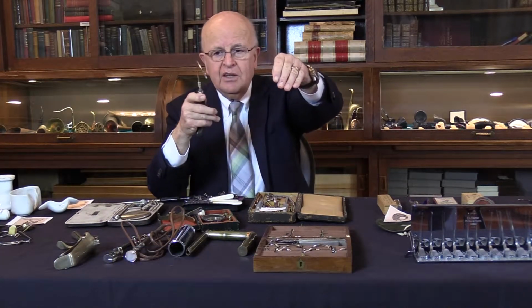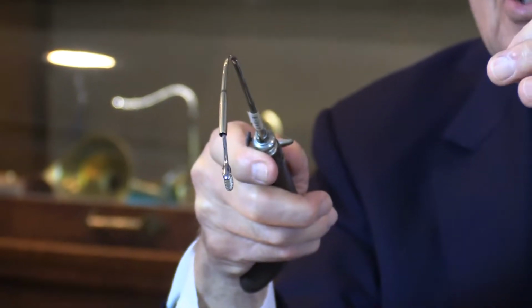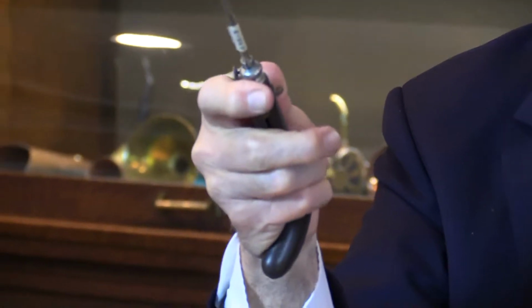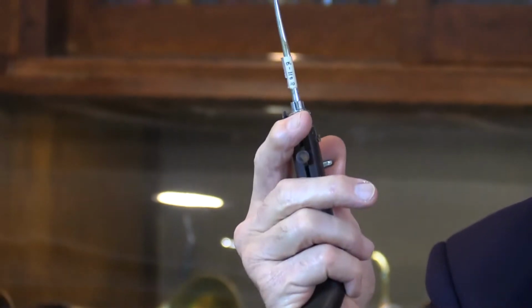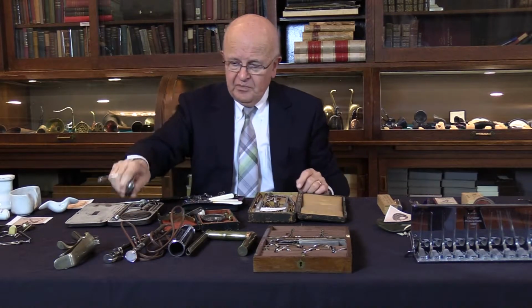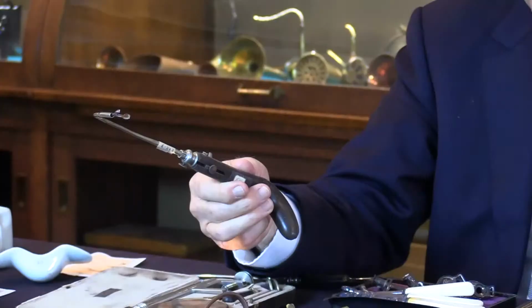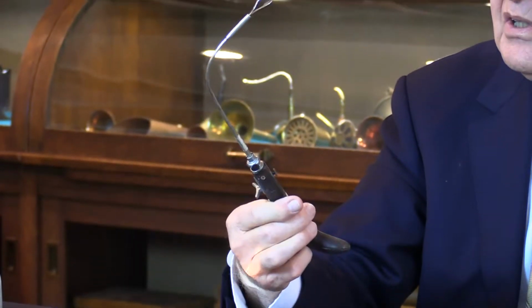To remove a polyp or take a biopsy, they used to use the laryngeal mirror with one hand and introduce this here after dripping some cocaine and numbing medicine on the vocal cords, and that will bite the polyp or take a biopsy. Again, it has an ebony handle. I would say this was most likely developed by Green. Green was a famous laryngologist in around the late 19th century.